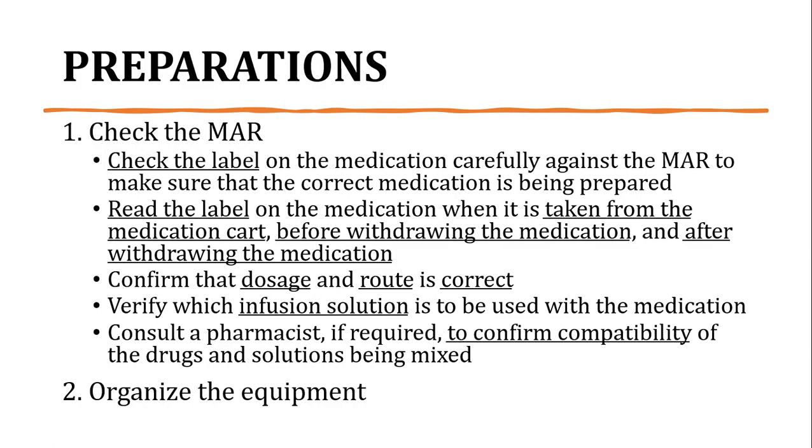Read the label on the medication when it is taken from the medication cart and before withdrawing the medication and after withdrawing the medication para ma-sure po talaga na yung medication na i-administer or ilalagay dun sa intravenous fluid container is yung ordered by the physician. Confirm that dosage and route is correct.